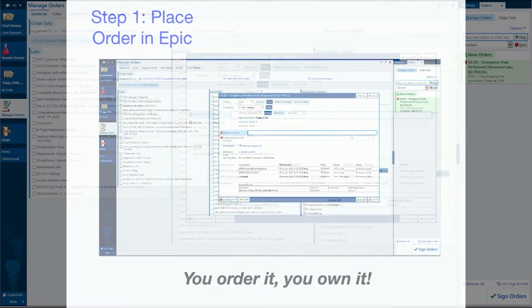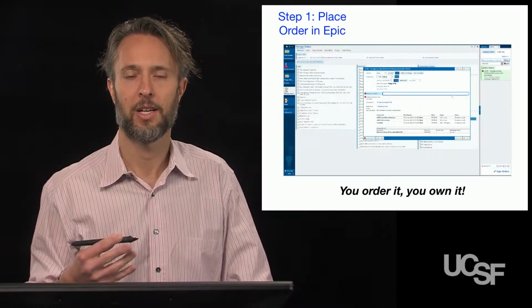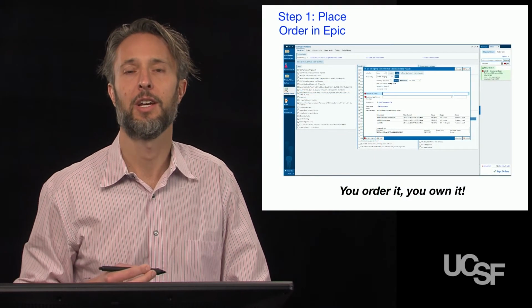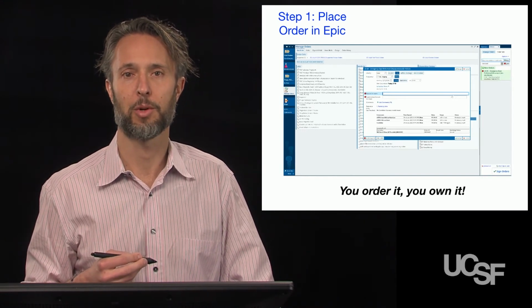Important thing to remember here is that this process of ordering the study basically claims it as yours and gives you responsibility for ultimately performing it and putting in the interpretation.